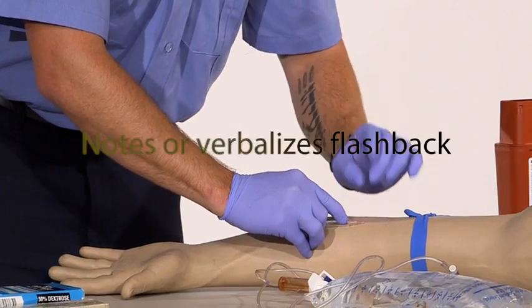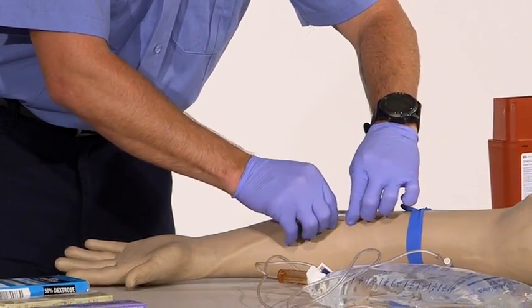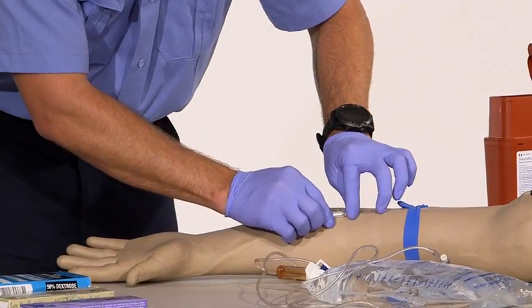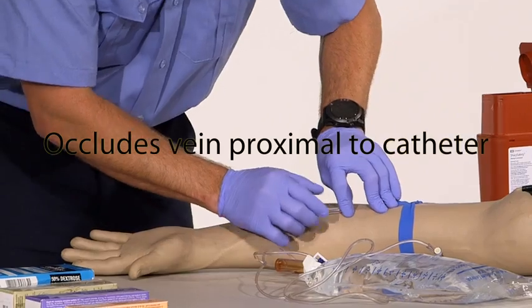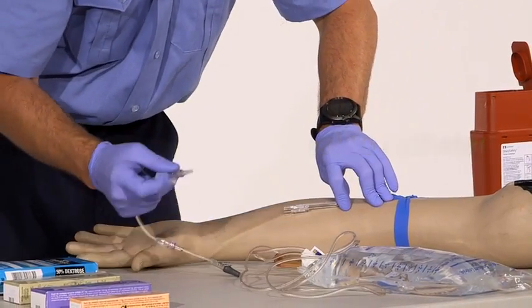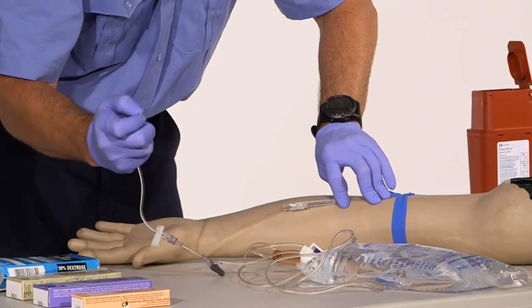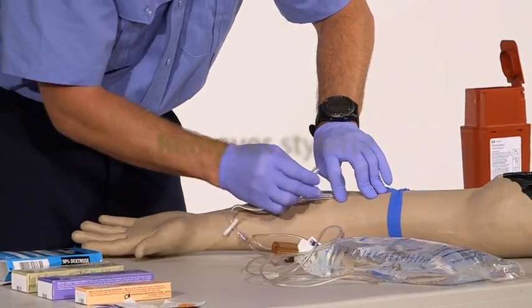I'm going to make sure that I keep secure hold of this. And this here, I'm going to occlude the vein. Site clean.